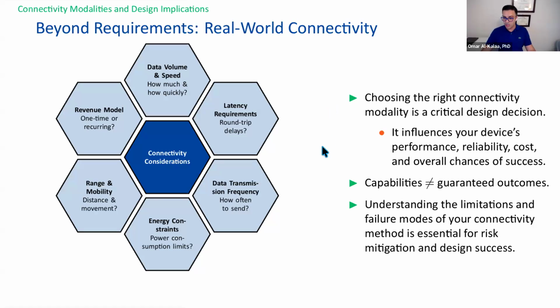So choosing the right connectivity modality is really a critical decision. It will influence how your device is designed, how it's built, how it's verified and validated, and how it's tested. Now, another important point is that just because a wireless technology was designed to achieve certain capabilities, that doesn't mean that you're going to see all of those capabilities in practice available to your device. There are always trade-offs between the different factors that affect the wireless connection. And the more you dive into your use case, the better clarity you should start to have about those trade-offs so that you can select an adequate connectivity modality.